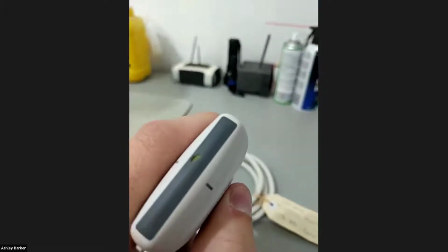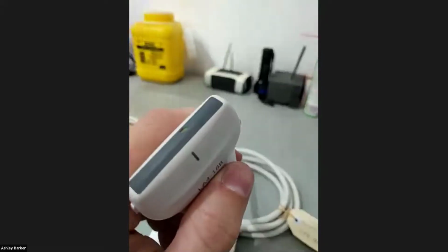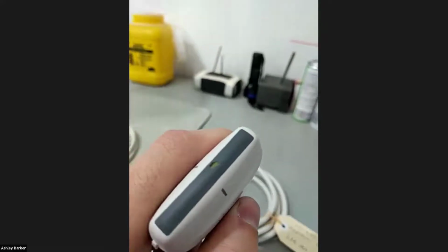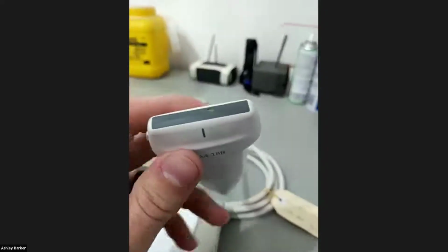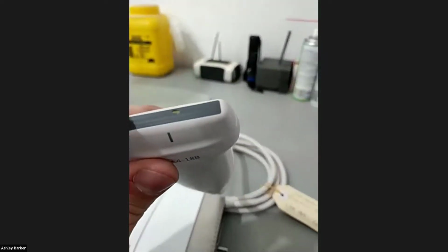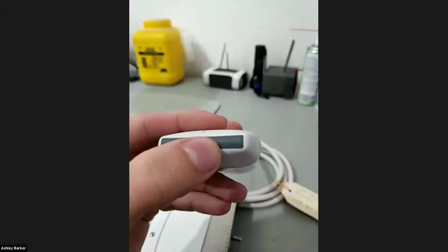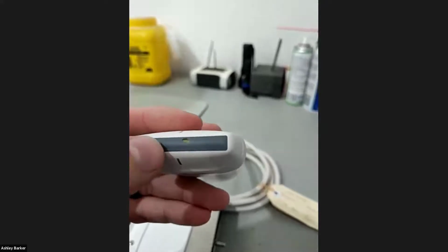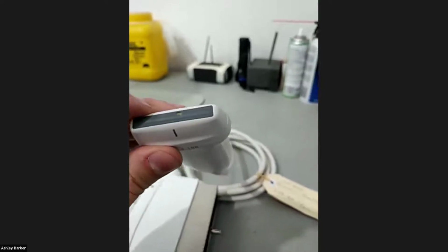I actually did a video a few years ago where I produced a fault in a machine and had the lens damaged on a probe. So it was a double fault, but yeah, basically it's possible to apply mains straight to the patient. So if your lens is damaged, you really want to get it fixed. A lot of the time, particularly if you're using alcohol to clean your lenses, you can start to see a crazing, and eventually the crazing turns to micro cracks, almost like a dry riverbed type thing. And that's bad too. So you really must not use alcohol to clean probes.